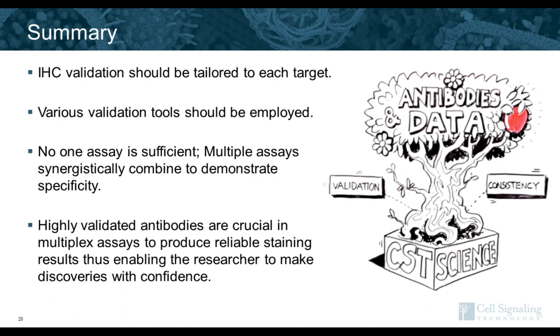The limiting factor would be having an HRP conjugated secondary antibody that detects an antibody raised in your species of interest. So if you had an antibody raised in, for instance, something like a chicken, you would need an HRP conjugated anti-chicken secondary in order to use that antibody in the OPAL kits and in the multiplex setting. But the simple answer is yes.